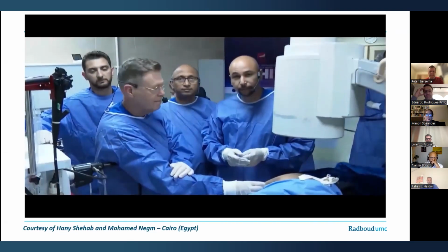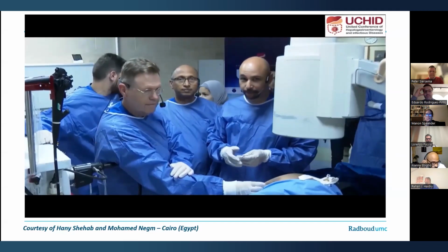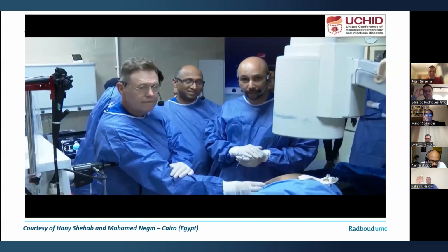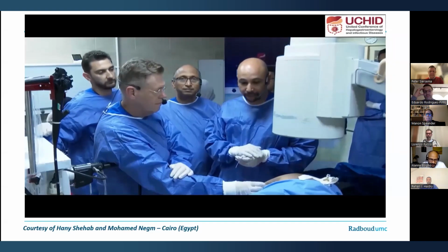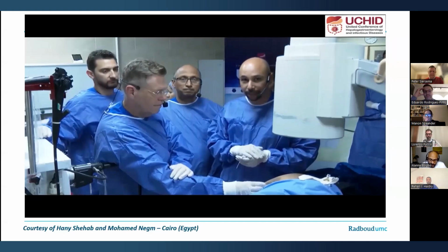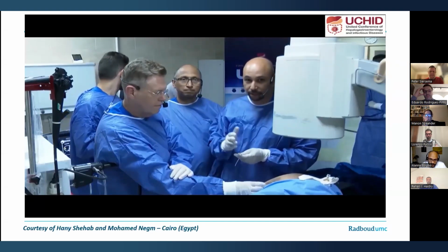Hello, everyone. Of course, I'm very happy to be here with, I think, the best experts in the world who can do this very difficult case. As you have seen in the introduction, it's a very difficult case, and we're going to try something that has been tried a few times. It needs a lot of experience and courage.